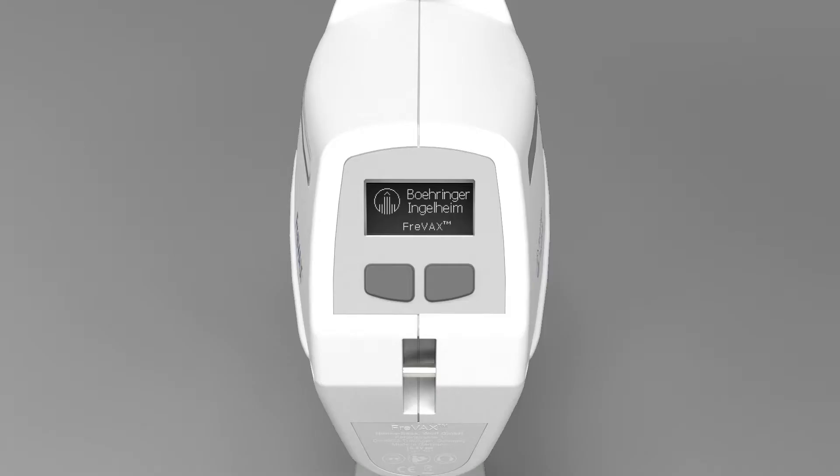The initial display of the user menu will show the most relevant information. The dots at the bottom of the screen indicate the current menu page. The user menu is divided into two levels: the first level contains all settings that can be changed or reset frequently, such as different counters and the injection volume. The second level contains settings that only need to be changed infrequently, particularly affecting the sensor technology of the device. In both levels, move through the menu by pressing the right display button, and change or reset the respective presets with the left display button.